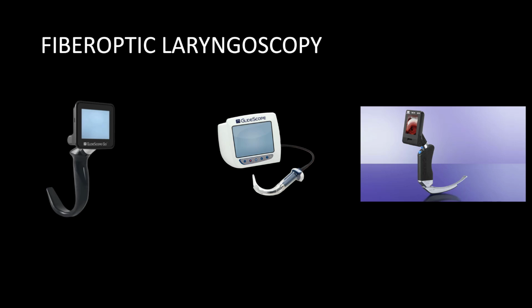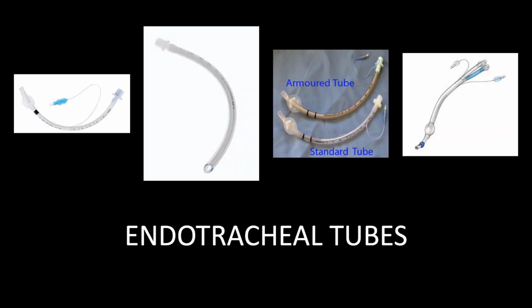Just in general, some of the advantages of video laryngoscopy is that it does negate the need for direct line of sight of the airway. It helps magnify the view of the airway for the entire team and allows your assistant to visualize what the intubator is doing. Generally, they may require less force to intubate when used appropriately. And it obviously allows for supervising practitioners and airway assistants to be involved in the procedure when they're not the ones holding the laryngoscope.